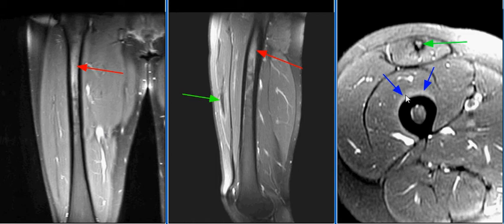There is periosteal edema along the anterior aspect of the proximal femur, consistent with a thigh splint or stress reaction.